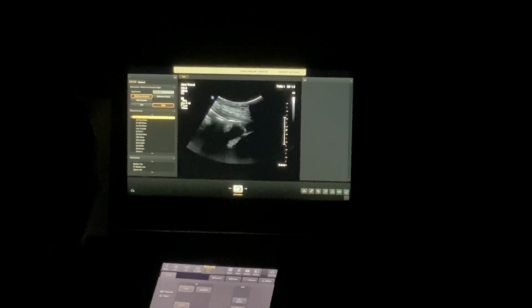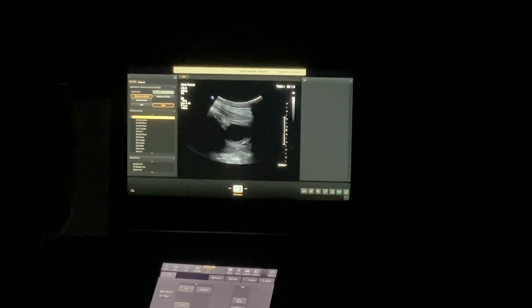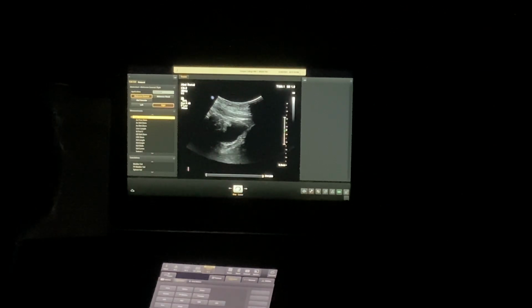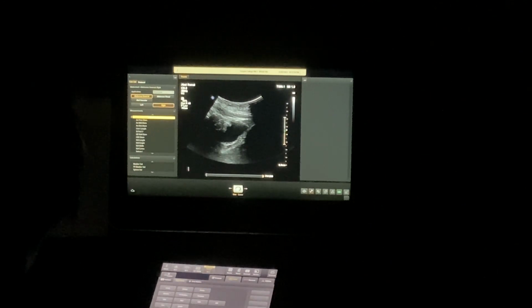It's so long. Okay, so your long is gonna be where it looks the widest. There, kinda. Bowel gas moving here. Yeah, not so much there. It's less so. Okay, so probably that might be the largest right about there. You would need to clear those echoes and of course keep contact, but that's what I mean when I say you need to go lower, right? So when I was doing trans, I'm like way down here on you, okay? I'm not looking at it, I'm looking here. So keep that in mind. We're not ogling somebody's pelvis, but you're going to need to go lower than you think you will.